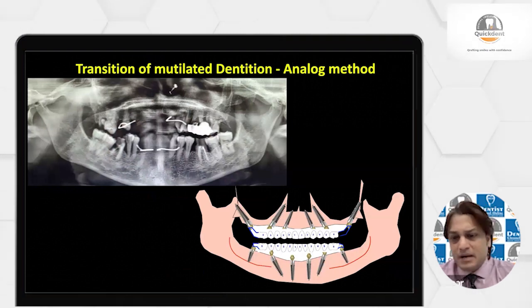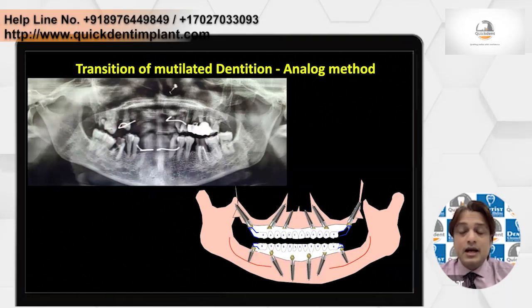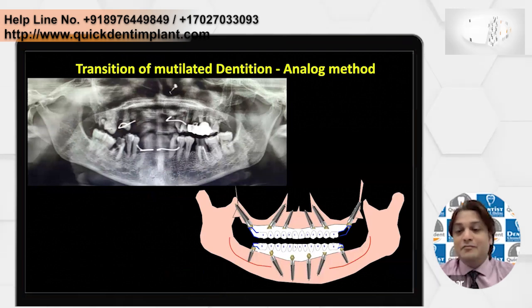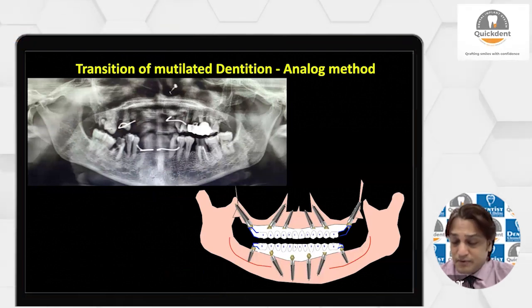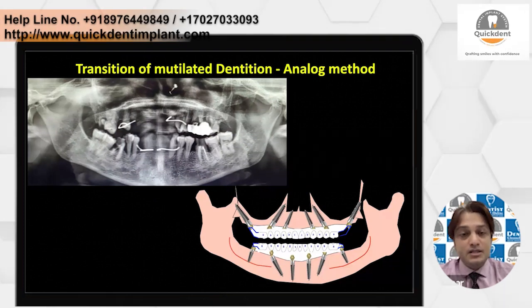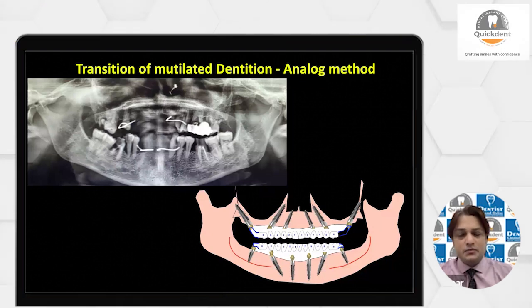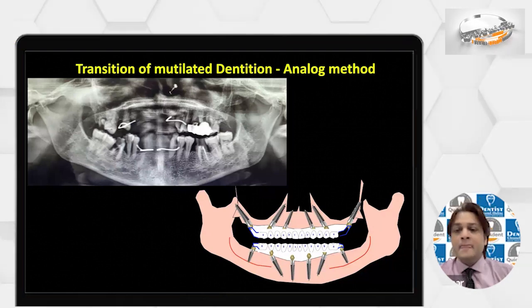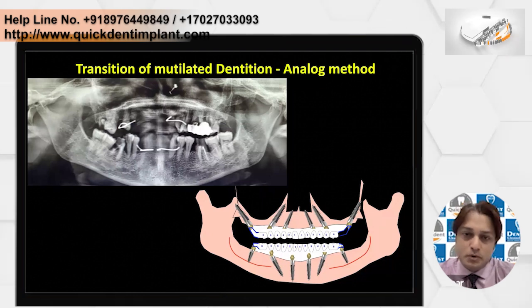Usually my method is that we place implants in the premaxilla and in the intermental foramen, and we avoid cantilever by placing pterygoid implants or zygomatic implants if required. In the lower jaw, we engage the implants into the cancellous bone, or lingual cortical engagement, or buccal cortical engagement, wherever the bone allows us. That's how we totally avoid cantilevers in the upper and lower jaw. That's the most important aspect.